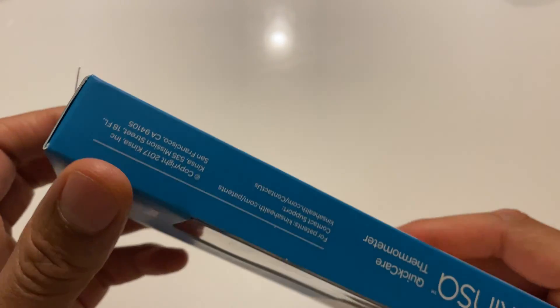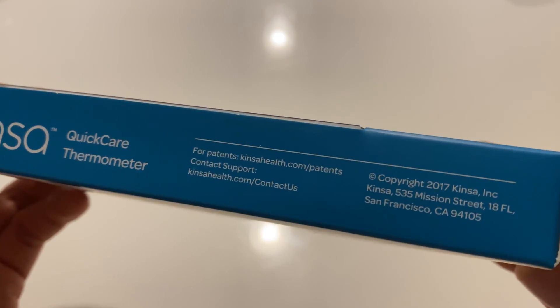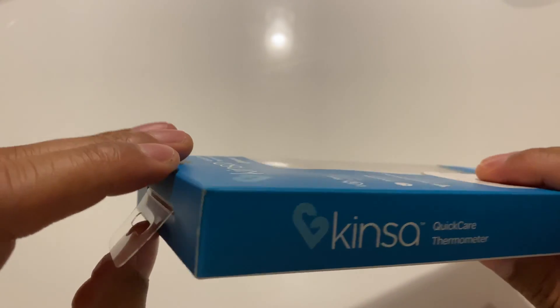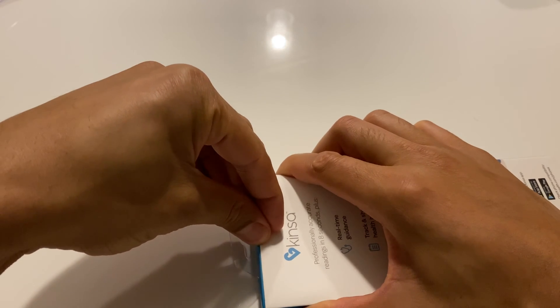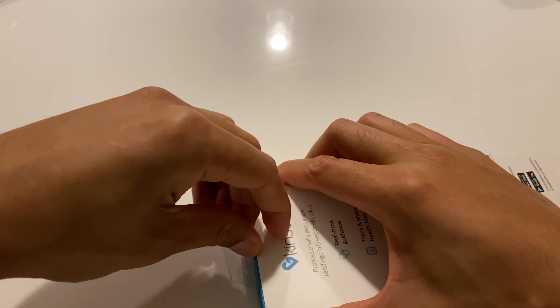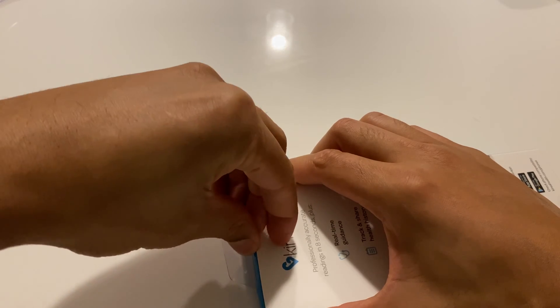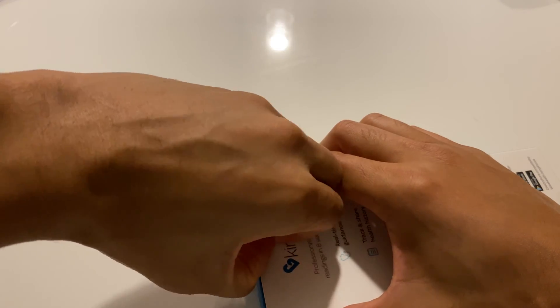Let's go ahead and get this open. I'm going to check the side to see if there's any other relevant information. It just says Kinza Quick Care Thermometer. I'm going to open this from the top — I believe it slides open right here. There's some plastic keeping it in here, so I'm just going to peel this back a little bit. It's a little bit difficult; if it doesn't come off, I'll probably just take some scissors.